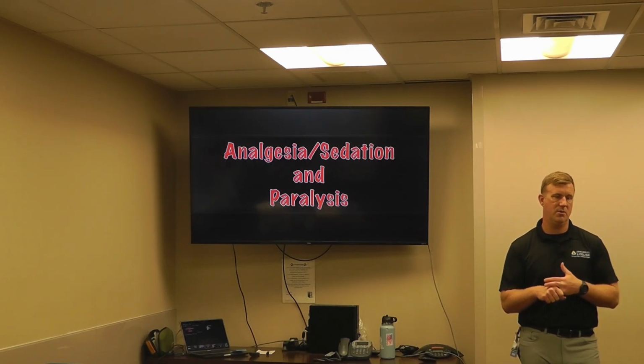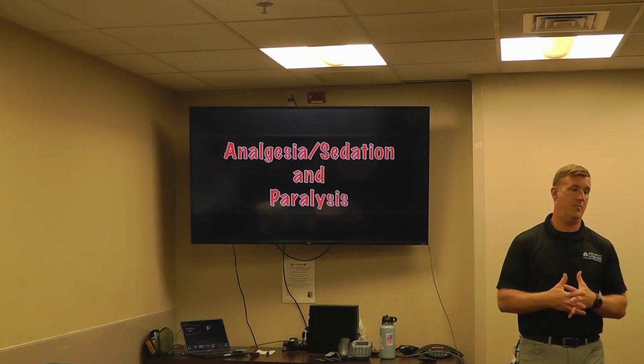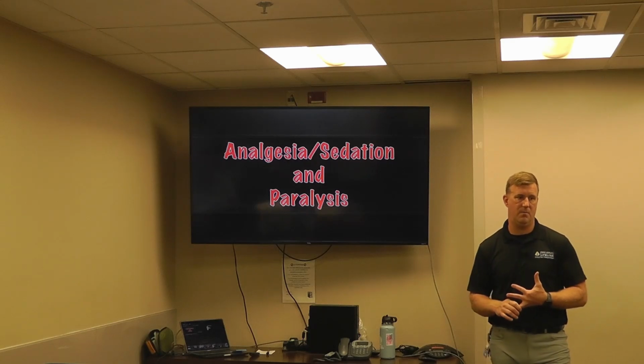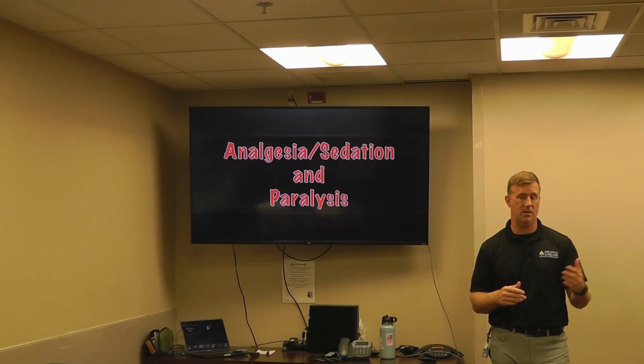Most of the time we don't need to paralyze our patients if we can get the ventilator synchronized with them and get the ventilator programmed appropriately to achieve their goals. There are a handful of patients where paralysis is sort of your only option and will go a long way. We saw a ton of it during COVID.